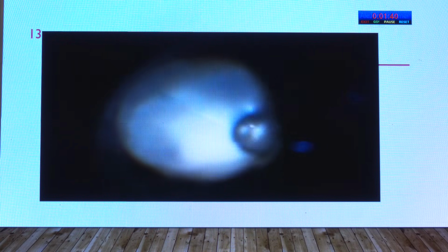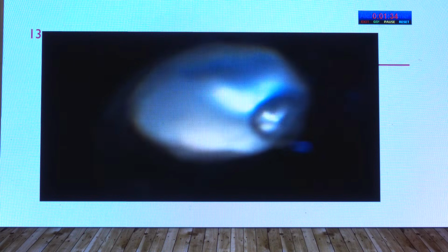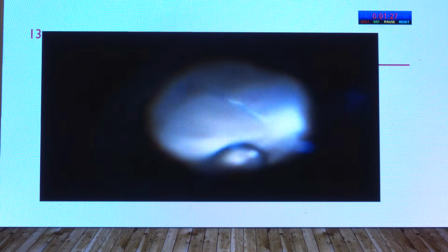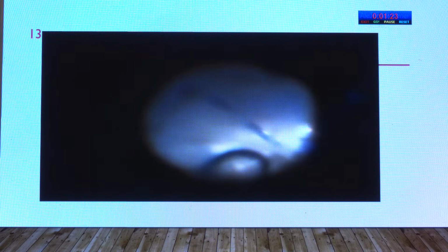Nicely, vitrectomy is done. We don't go for an aggressive vitrectomy. We just do a core vitrectomy, and to the extent possible, so that all the exudates can be removed and there is a nice flow from the vitreous.